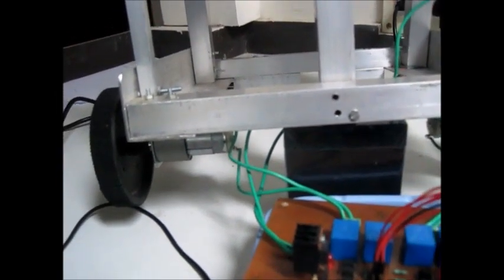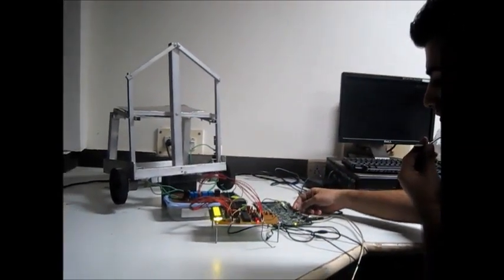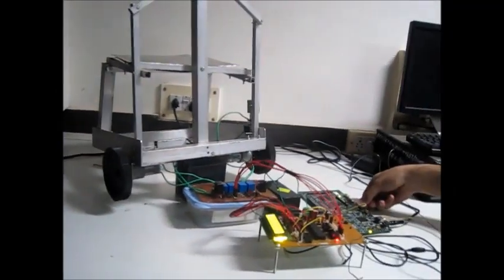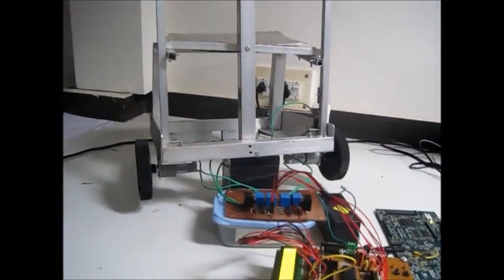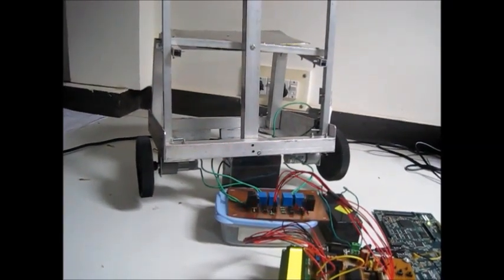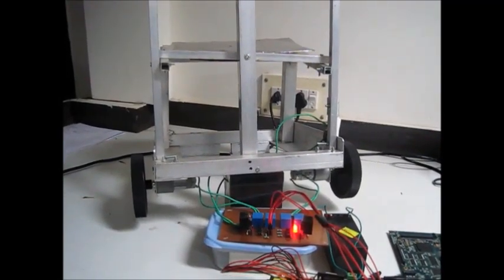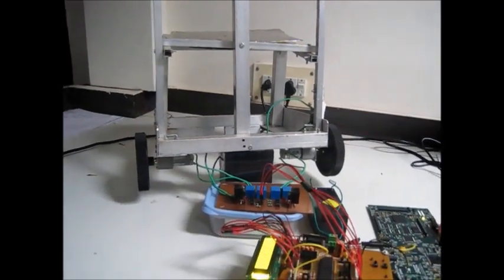Now let us see the demo of the wheelchair control using voice operation. Right, back, left, forward.